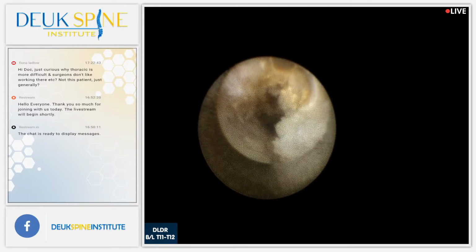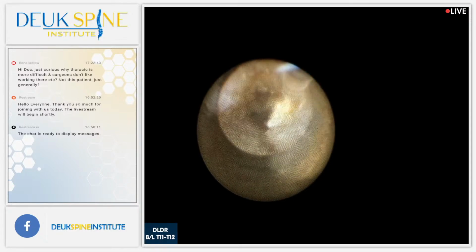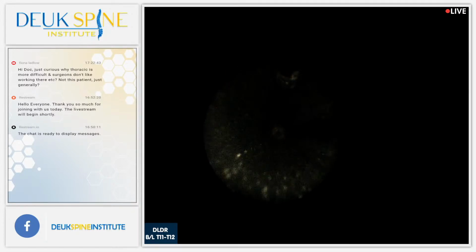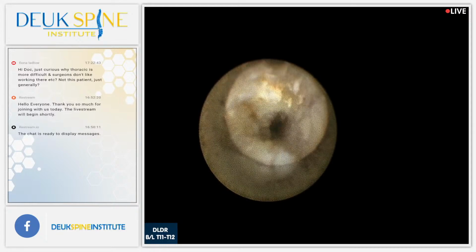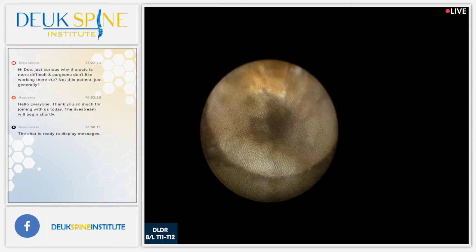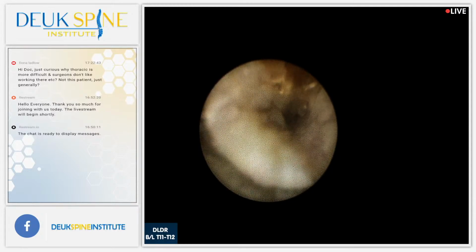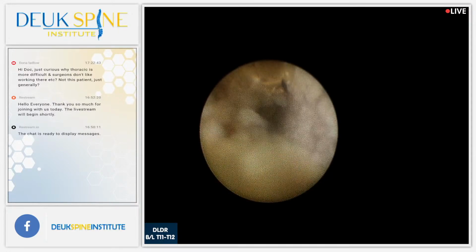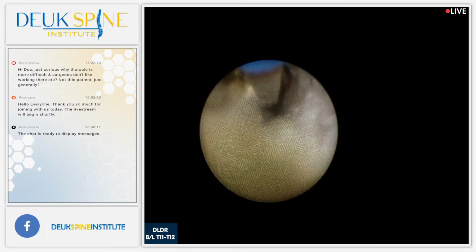Pathologists of old used food references to describe pathology, right? Port wine stain, caseating necrosis, you name it. The pathologists love to use food terms to describe pathology, so I'm just trying to stay in that vein. So it's kind of like hard wax, not soft wax, like candle wax. I think candle wax is fair. It's fair to describe these thick collagenized herniations as being a lot like hard candle wax.